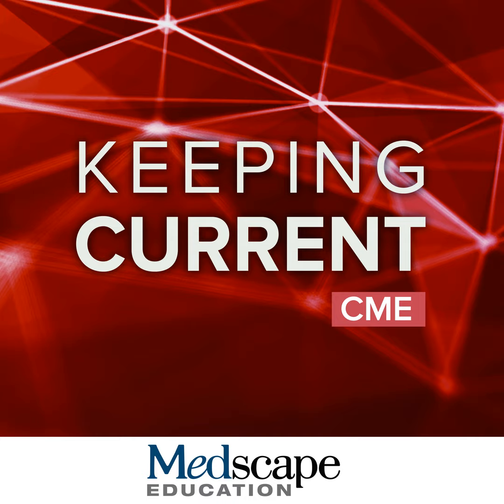And some of those treatments are associated with a condition called ARIA. And ARIA comes in two flavors. You have ARIA-E, where you develop brain edema as a result of the treatment. And ARIA-H is the second flavor, where you develop microhemorrhages that can potentially lead to larger hemorrhages. And patients receiving those new treatments need to receive serial MRIs in order to try to detect early those possible complications of the treatment, ARIA-E and ARIA-H.